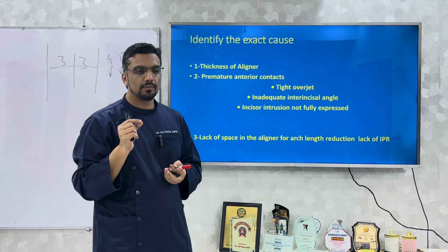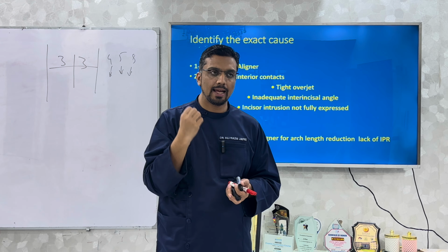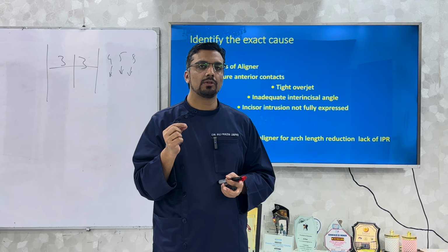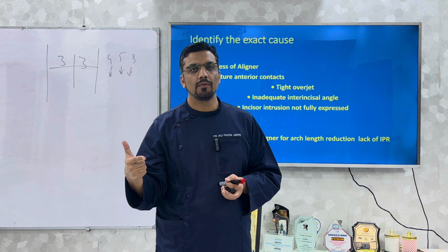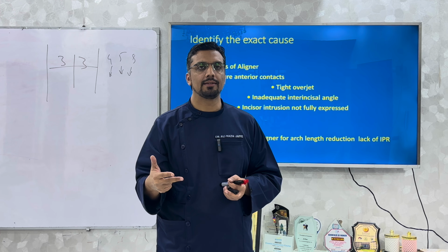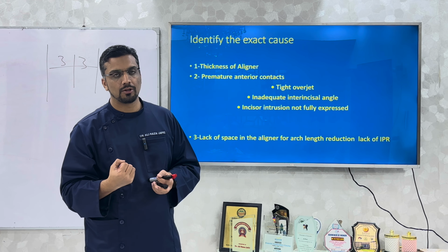This is for the low angle patient, or the patient who has the habit of chewing the aligners after wearing them, so you can control the mild intrusion of the teeth by the nocturnal wear of the aligners or by trimming the aligners up to the distal of the canines, so the posterior teeth relapse and come into the occlusion again.